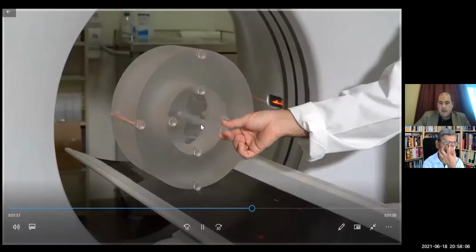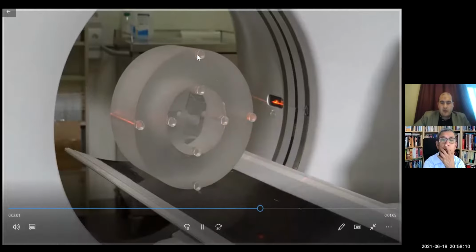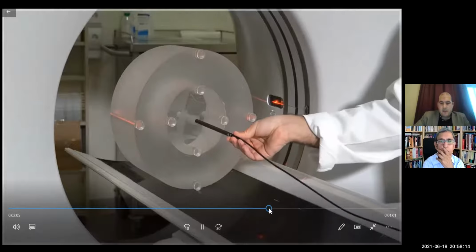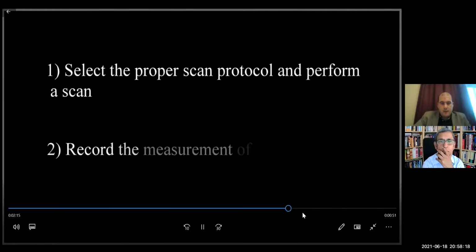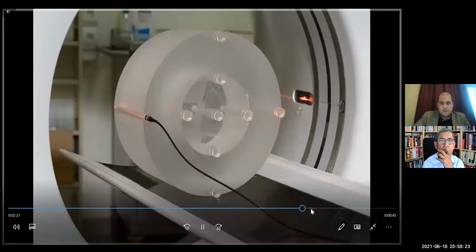We are using the center hole only, but we are using these peripheral holes for measurements. Okay, same.